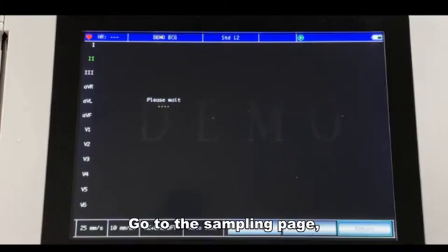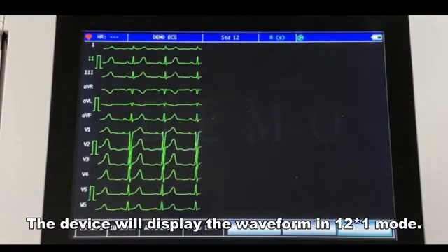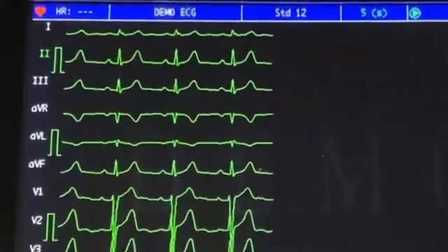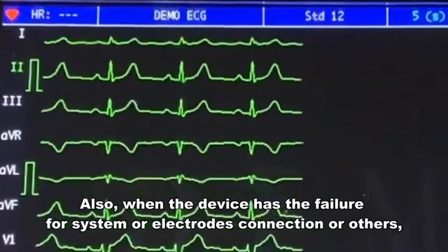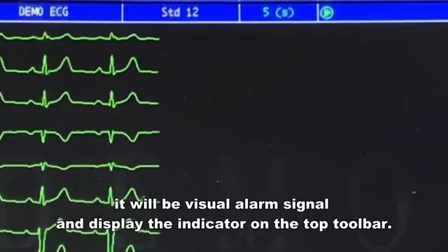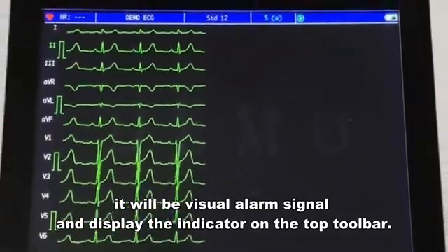Go to the sampling page. The device will display the waveform in 12×1 mode, and there is the heart rate on the top toolbar. Also, when the device has a failure in the system, electrode connection, or others, it will show a visual alarm signal and display the indicator on the top toolbar.